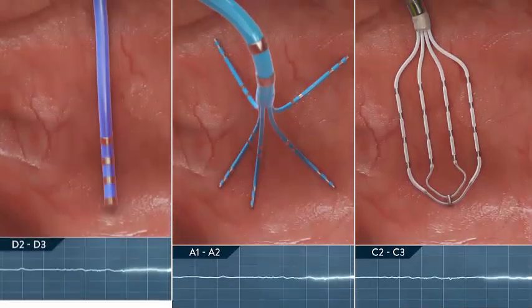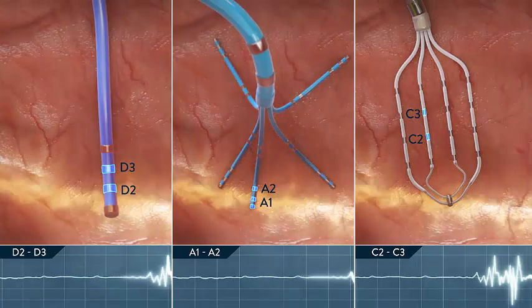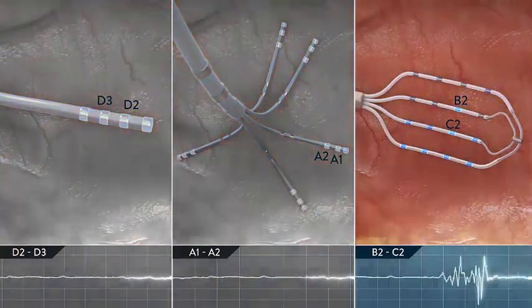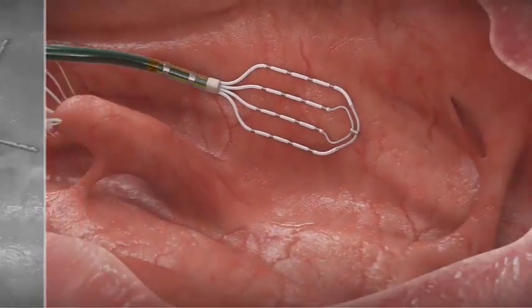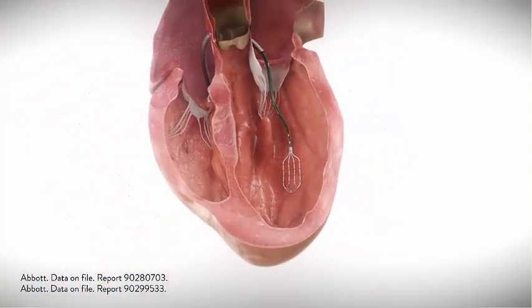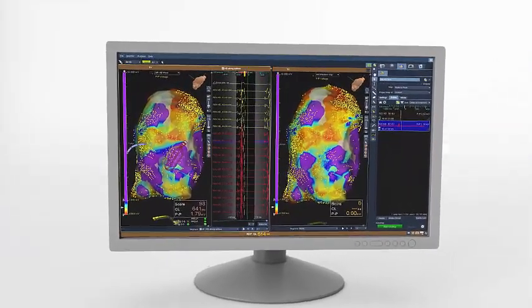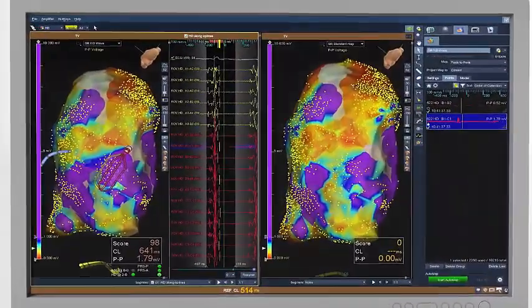Unlike traditional mapping catheters and branched spline catheters, the Advisor HD Grid Mapping Catheter, sensor-enabled, gives you reliable data in any direction. The grid provides the coverage of a single or double loop catheter with predictable navigation and consistency compared to a branch catheter. When used in conjunction with the EnSite Precision Cardiac Mapping System, the highest amplitude data is collected and displayed on the map.